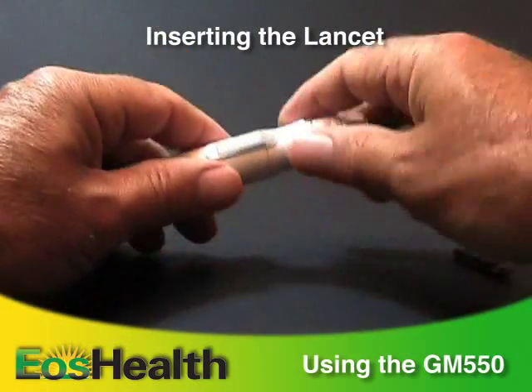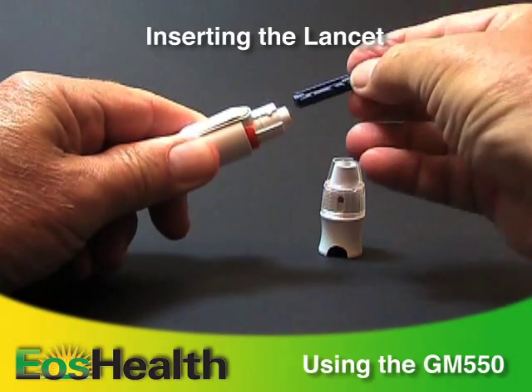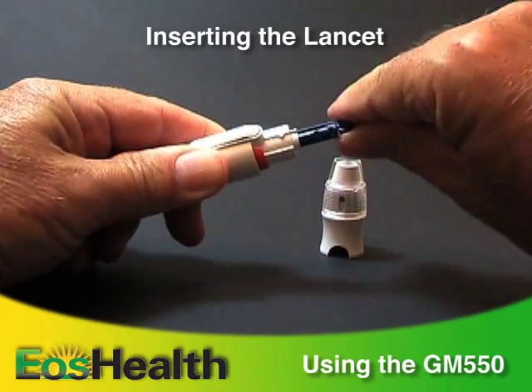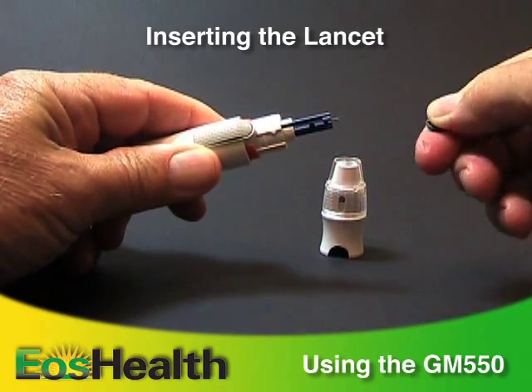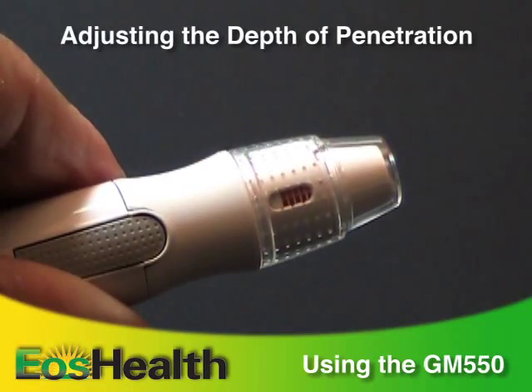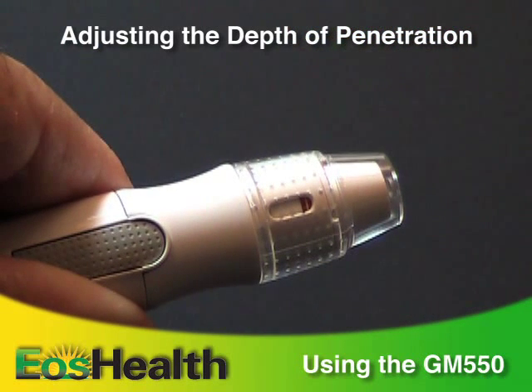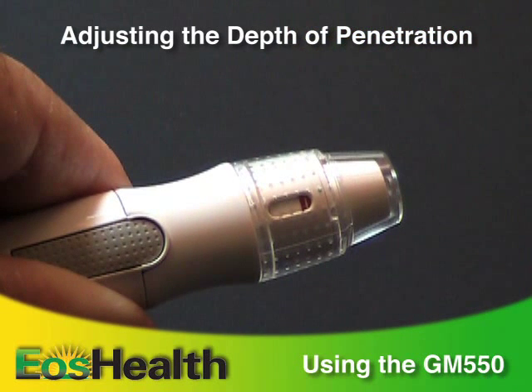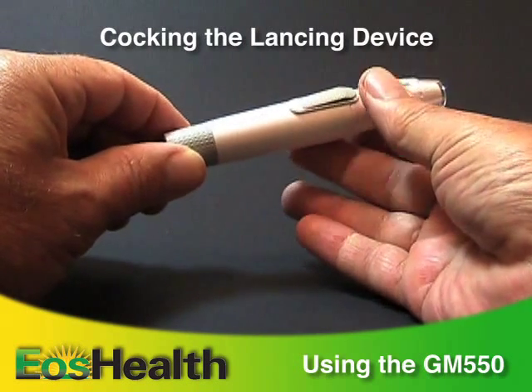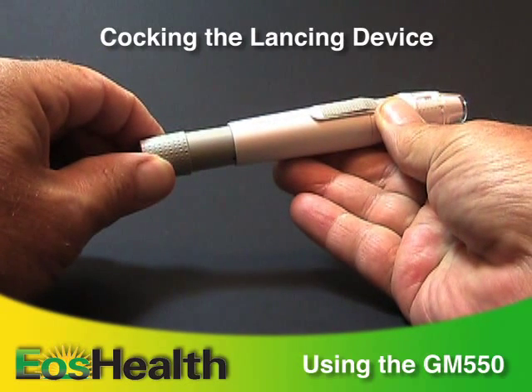Pick up the lancing device. Pull off the depth adjustment cap and insert a new disposable lancet. Twist off the protective cover of the lancet and replace the depth adjustment cap. Choose a depth of penetration by rotating the top portion of the cap. Settings range from soft skin to thick or callous skin. Hold the lancing device in one hand and pull on the plunger in the other hand. The device will be cocked.